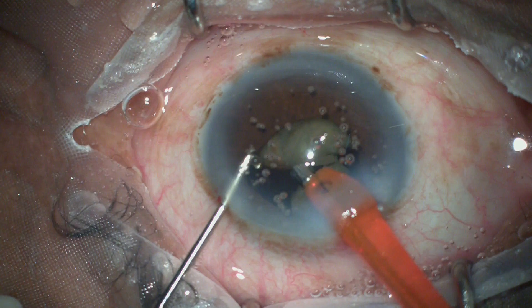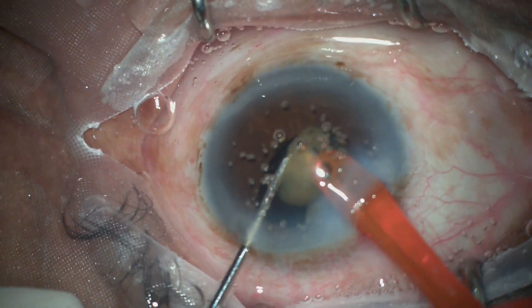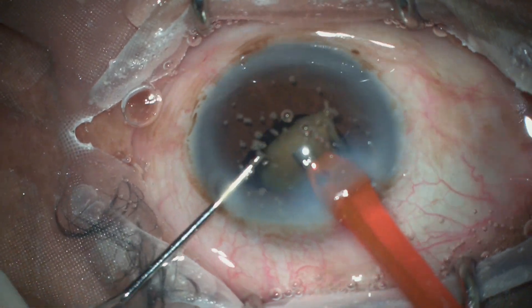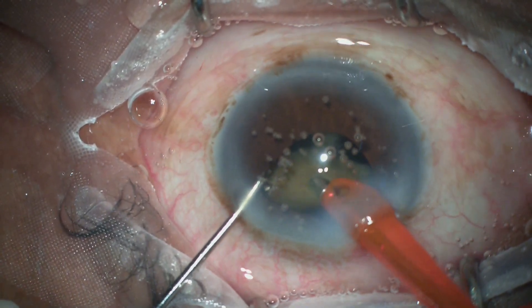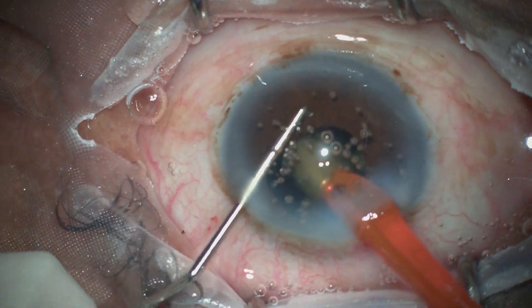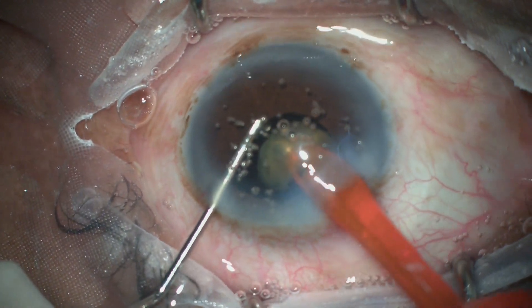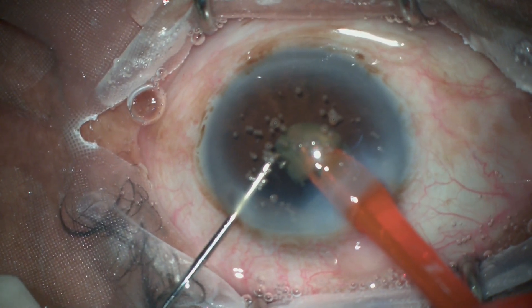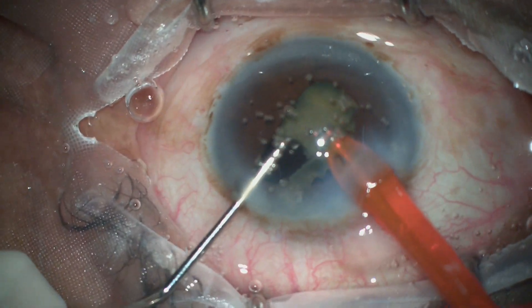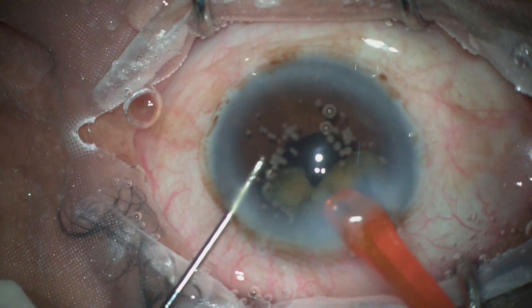This confirms that when nuclear pieces have been broken into smaller pieces and are being emulsified, using micro-pulse mode causes the pieces to follow the phaco tip for emulsification. If you continue using continuous or pulse mode, it will repel the pieces and prevent that magnetic flow where pieces come directly into the phaco tip.